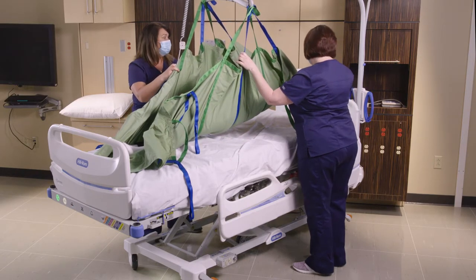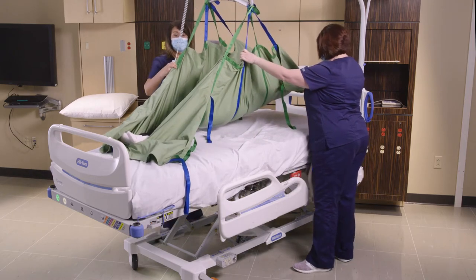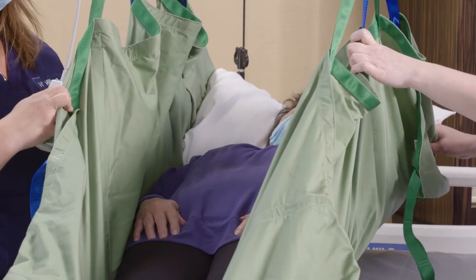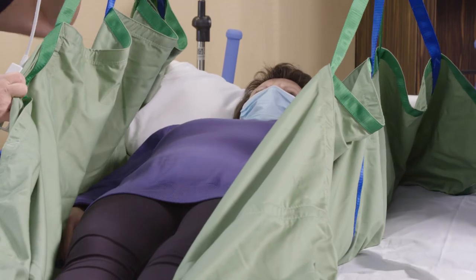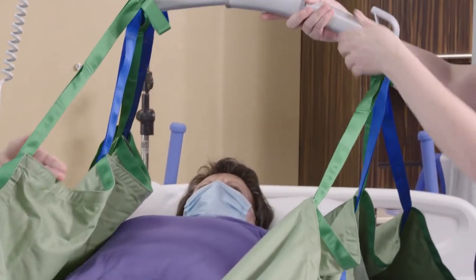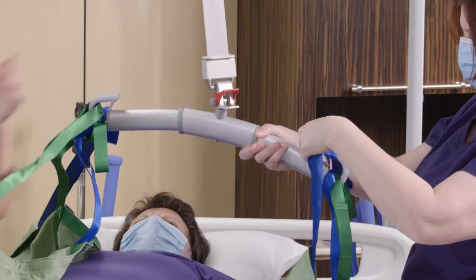I've gone ahead and cleared the surface. I'm going to boost the patient and pull her a little bit towards me, then lower her back down because we're going to turn our patient as well. Once she's positioned in the correct spot, my partner is going to take off her lift straps so we can turn the patient in that direction.